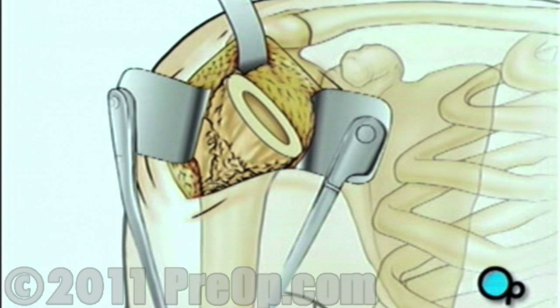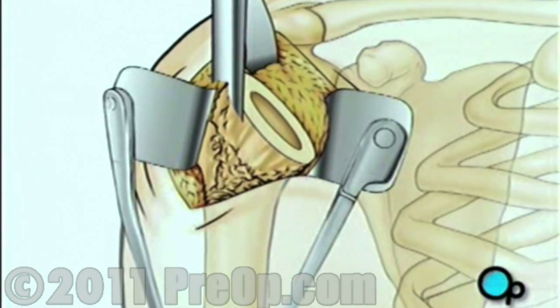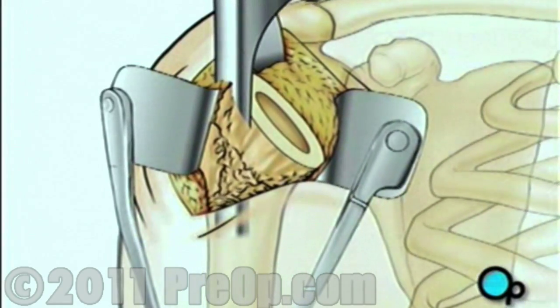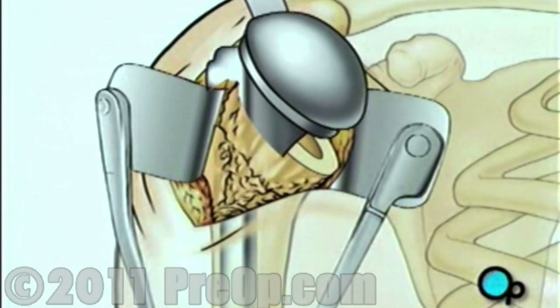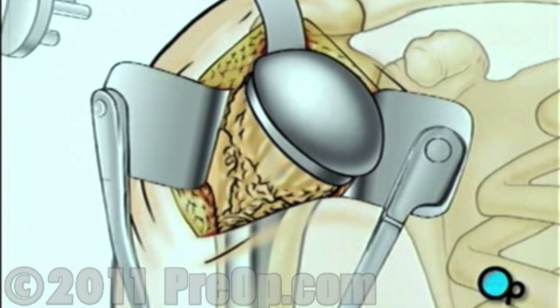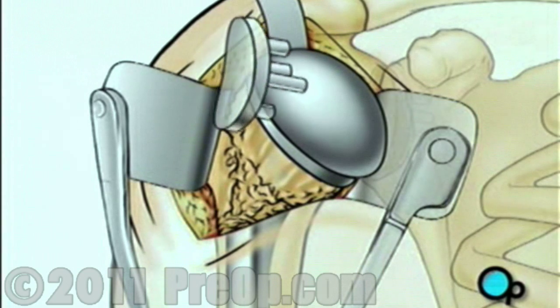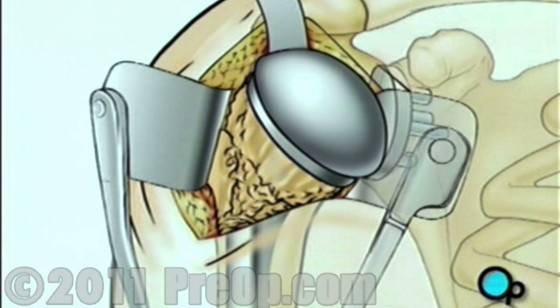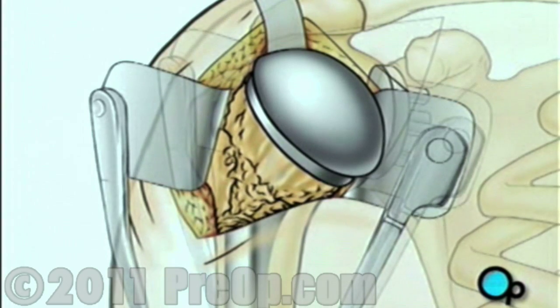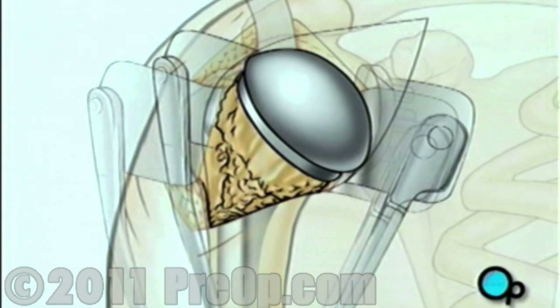Then the surgical team will use a high-speed drill to hollow out the top of the arm bone. A specially fitted artificial ball joint slides into the top of the arm bone. Next, your doctor will smooth the inner surface of the shoulder socket. Once the socket has been thoroughly cleaned, the artificial lining will be secured in place. The artificial ball joint is turned inward and fit into the socket, and the team carefully checks to make sure it fits and allows the full range of normal motion.